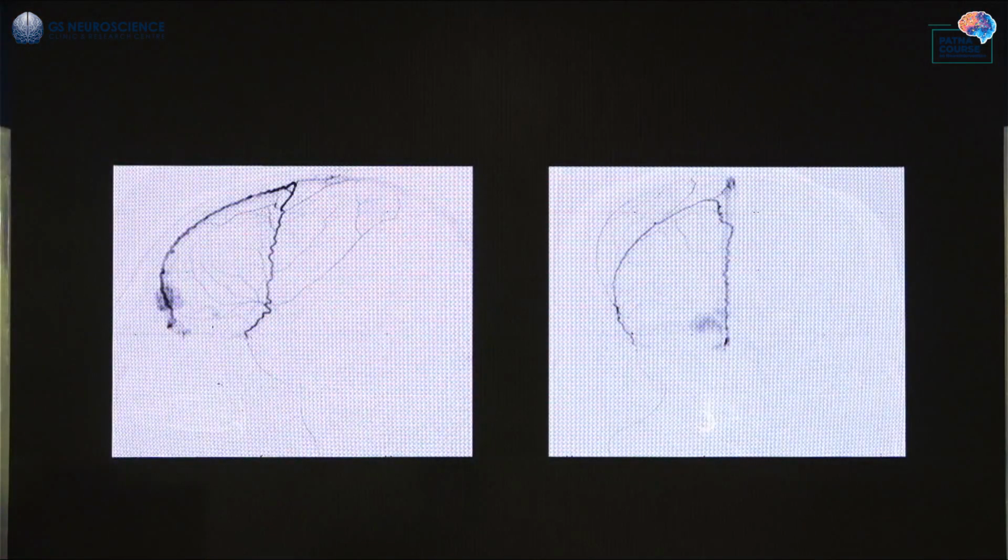We were discussing the meningeal system. Any disorder of the anterior cranial fossa is going to be supplied by the meningeal system. So this is a middle meningeal artery which was very, very tortuous, and then subsequently it had an anastomosis with the artery of the falx cerebri, and this was going to supply a dural malformation in the anterior cranial fossa. That's why we decided that it is obviously not possible to negotiate this vessel and reach up till here. So this vascular malformation was treated via the anastomotic branches from the ophthalmic artery itself. We'll see that in the workshop.